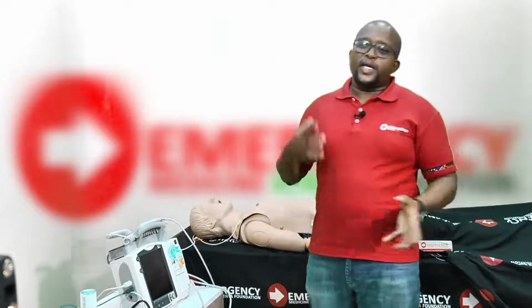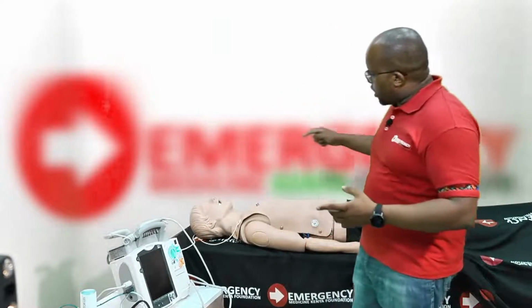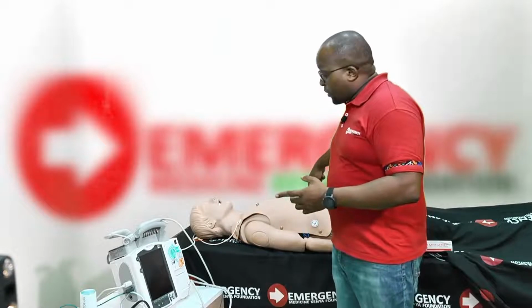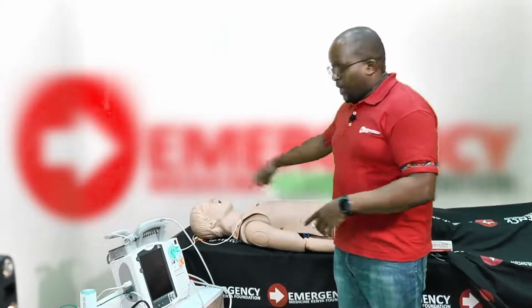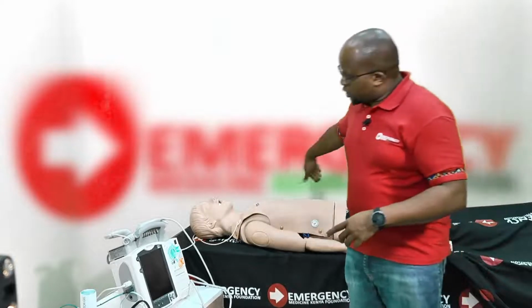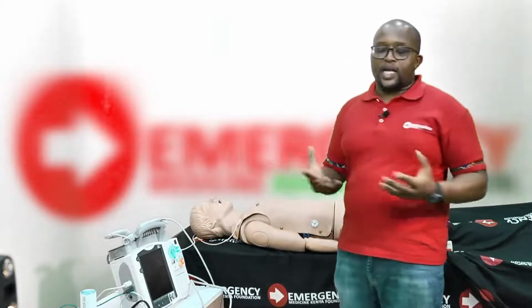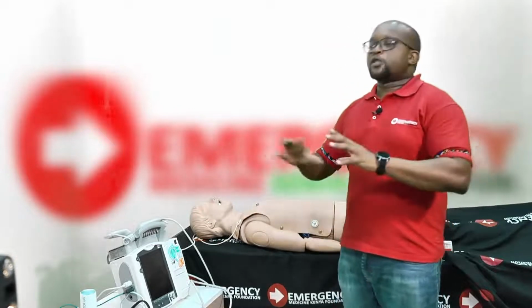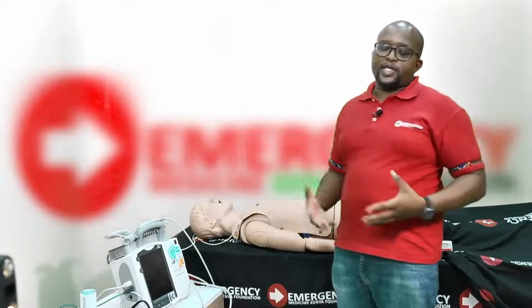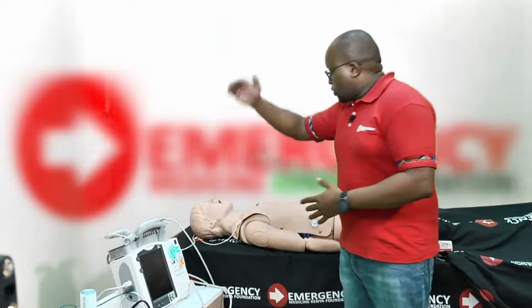Now, what's the main difference between monophasic and biphasic? For biphasic, you get electricity running twice: from one electrode, one paddle, to the other paddle, one way and backwards. Because of that two-way motion, you're using less energy. The first shock ideally primes the heart for defibrillation, and then the second shock defibrillates the heart. Because of that initial priming, a biphasic machine uses less energy to shock the patient. Monophasic just goes one way.